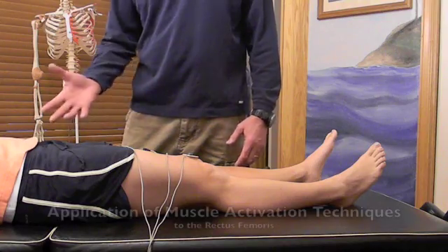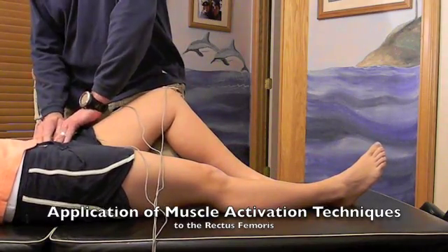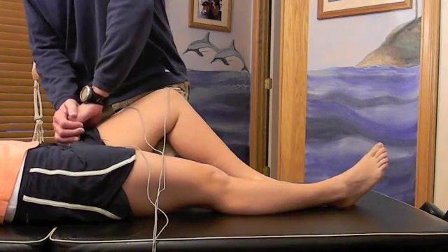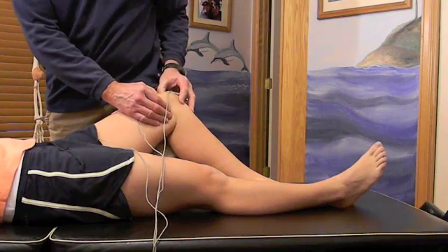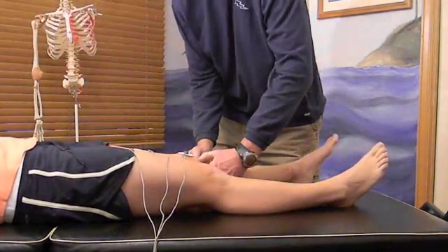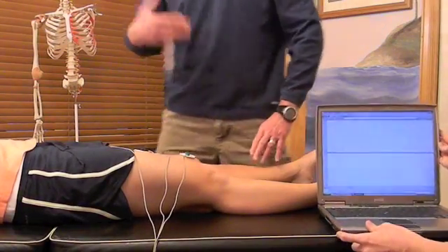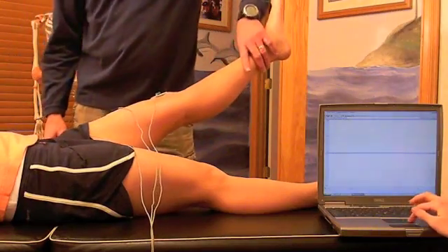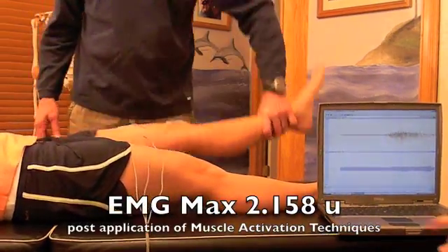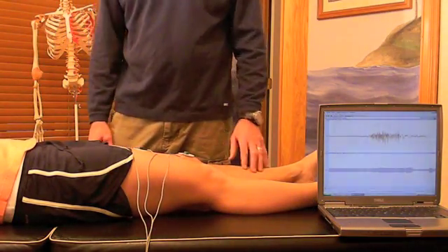Based upon the principles of muscle activation techniques, we can reset this muscle. We're going to go once again to the origin and once again to the insertion at the top of the patella and then just below the patella. Now we're going to retest even after she has strained her quadricep farther than it would normally go. Lift the leg — hold it there, ready, resist. Good. And once again we've restored its neurological ability to get proprioceptive messaging to that quad.